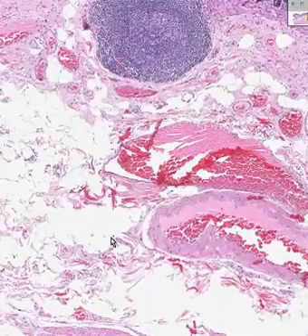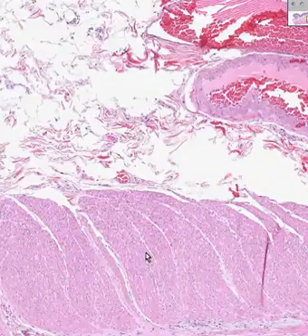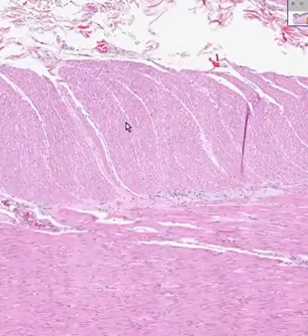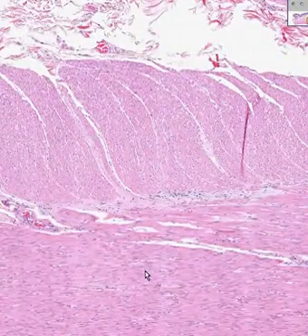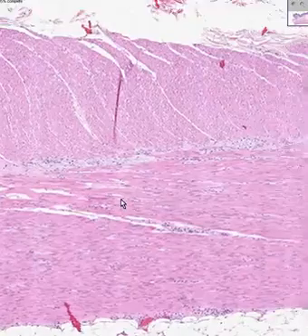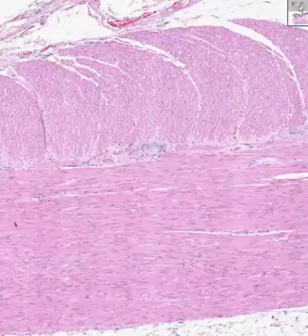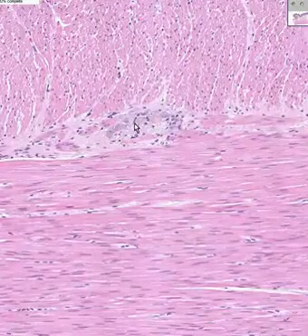Notice once again, you have another quite abrupt transition, and you can now see the beginning of your smooth muscle layers, circular on the inside, longitudinal on the outside. It is between the circular and longitudinal layer that you're very, very likely to find little ganglion cells, like here and here and here.